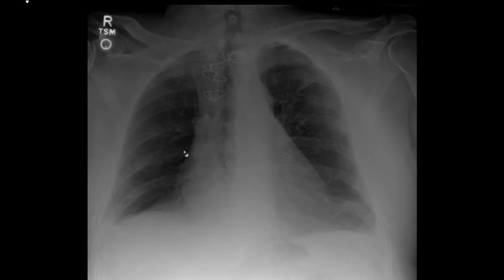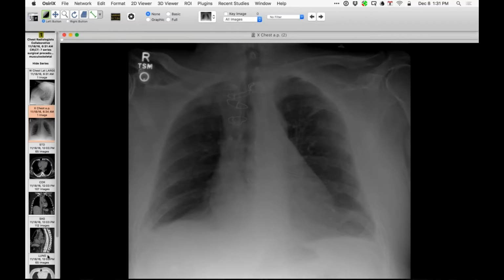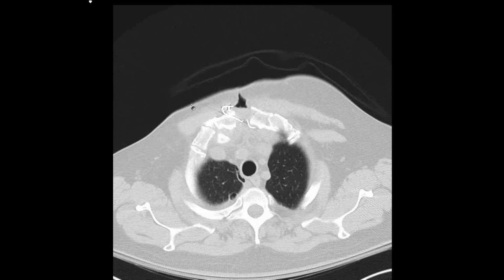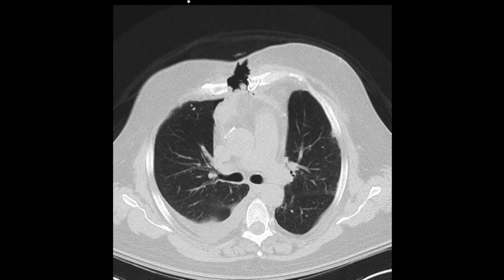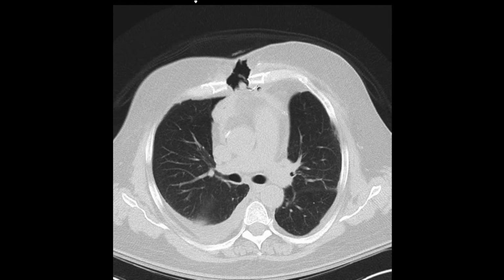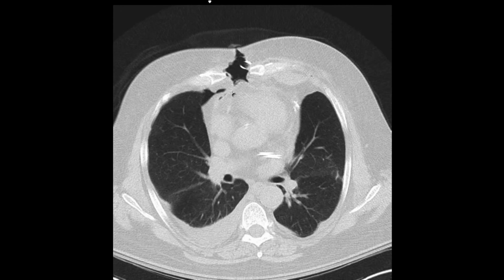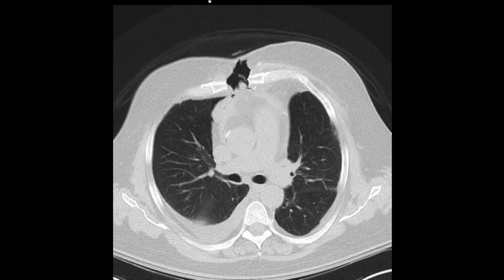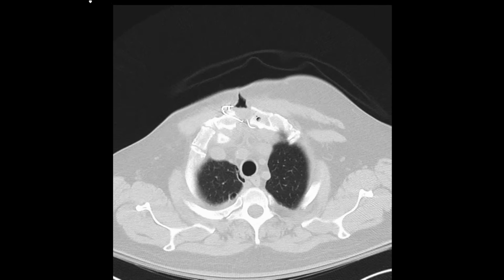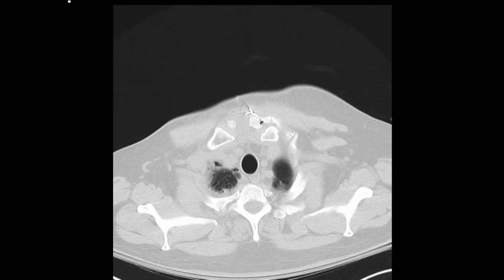But of course, his sternal wires are very abnormal. So here are some here, and here are some here. There's one there with a lot of lucency between them. So of course there is substantial disruption of the surgical incision, and you can see the big gap between the two parts of the sternum. Some of the sternal wires have torn through but have remained with the left part of the sternum. Some have torn through but have remained otherwise intact with the right side of the sternum. And then one particular wire stayed with the left side of the manubrium up high.